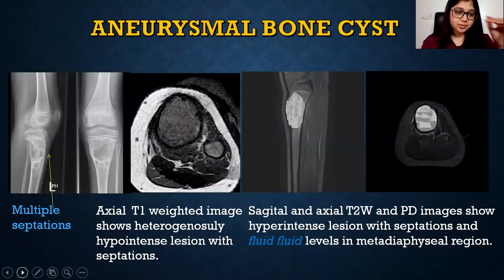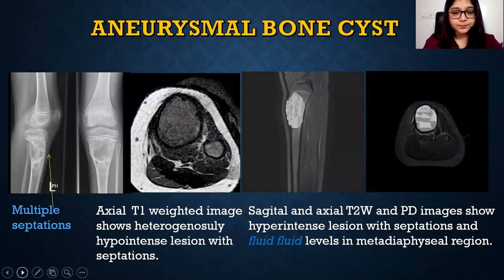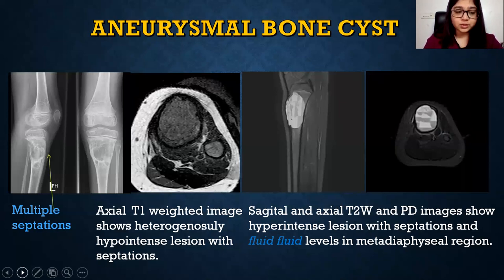A patient presented with pain and restriction of movement. X-ray showed a lytic lesion with multiple septations. Axial T1-weighted image showed a heterogeneous lesion with septation. Axial T2 and PD-weighted images showed a hyperintense lesion with multiple fluid-fluid levels, which depicts degrees of hemorrhage in aneurysmal bone cysts. This finding is not pathognomonic of aneurysmal bone cysts but is very commonly seen.